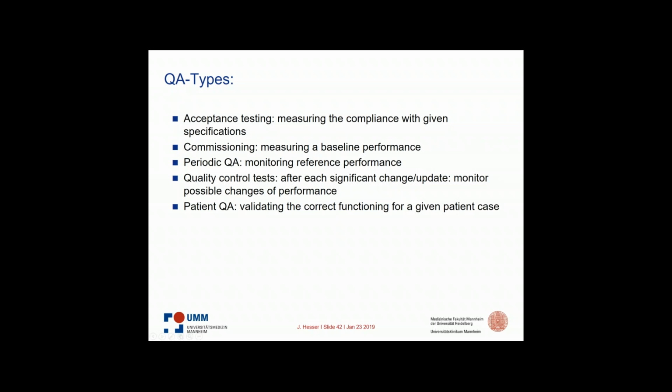We have so-called quality control tests. Each significant change, update, whatever, monitor potential changes of the performance. And then you have patient QA, and this is the very important daily part. You validate the correct functioning for each given patient case.